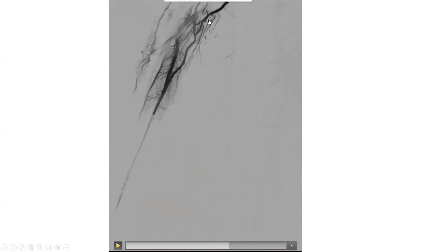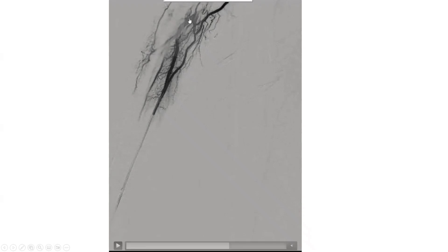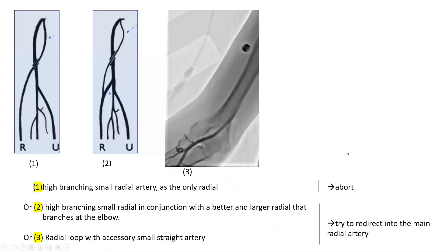We are encountering difficulties here. This is at the forearm level and this is the elbow. We can see this is the radial artery at the forearm and it splits into one main branching radial artery here and another high branching radial artery, and we are going into that one. There is no loop in that patient. Sometimes you have to confirm in an ipsilateral angle view that there is no loop being foreshortened in an AP view. This patient had no loop, so we were in situation two, which is the easier situation.